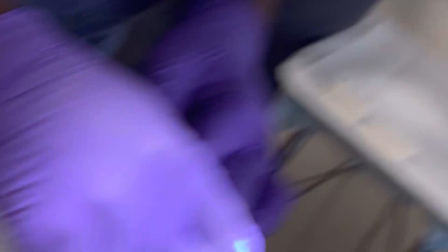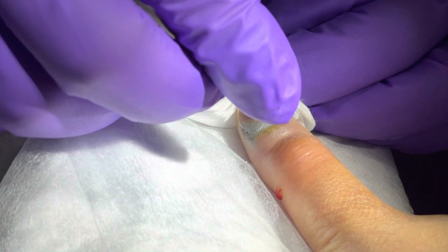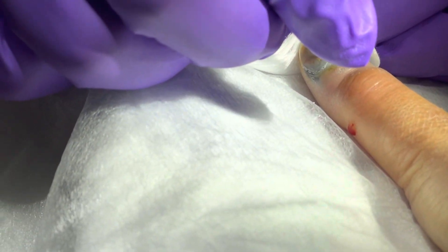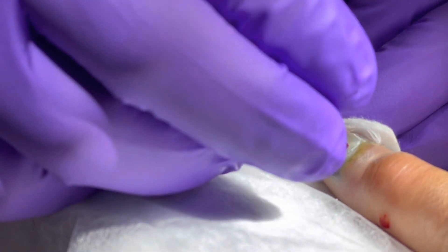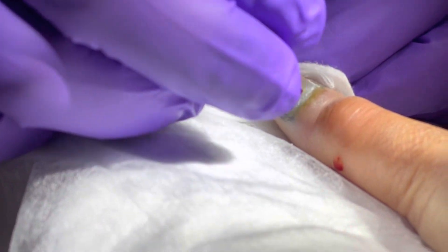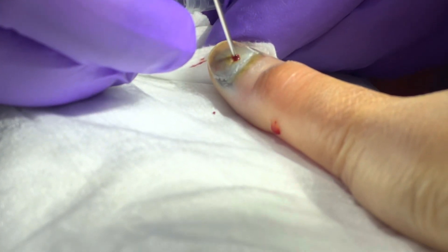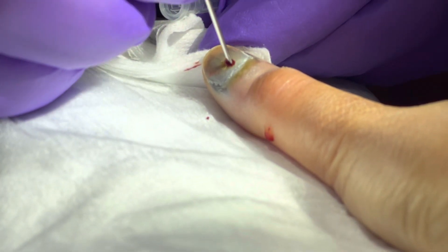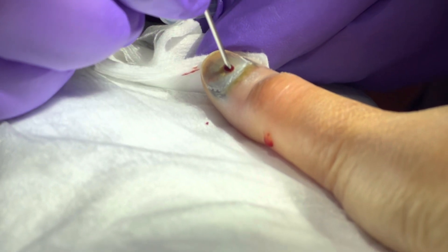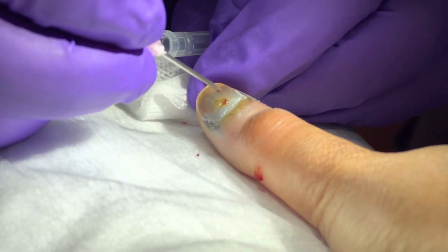Do you smell that? You wear a mask properly. So you go all the way down to the nail bed? I'm just trying to make the hole a little bit larger on that side. The blood's still coming out. The blood is already full because it's been like four days. Must be so much pressure under there. Like every day still throbbing.